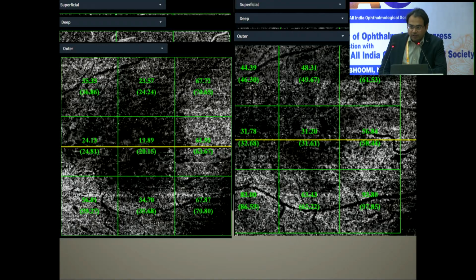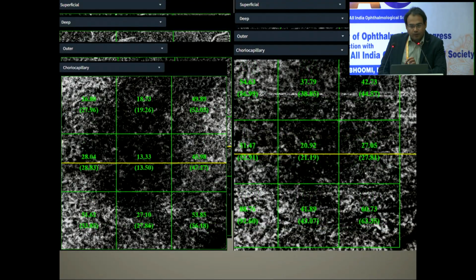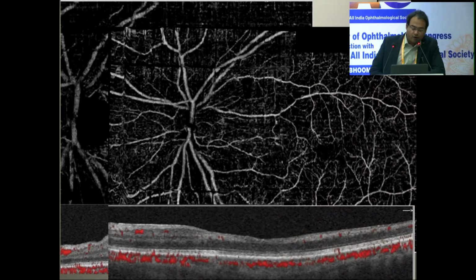So you can counsel the patient that there is some reperfusion happening, which you cannot do with an FFA or an OCT. And again, this is a non-invasive modality. This was a rare case of a triple cilioretinal artery sparing CRAO. You can see that the entire macula is non-perfused. After the treatment of the patient's cardiac illness, you can see how beautifully the entire retina is now reperfused.